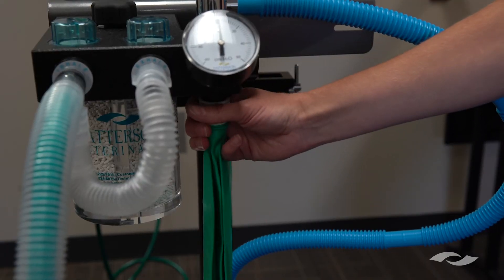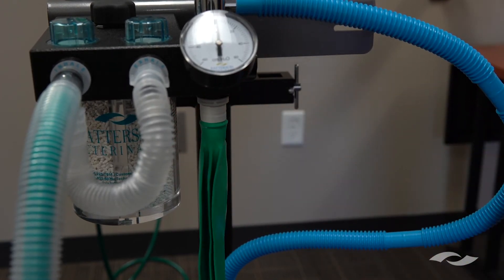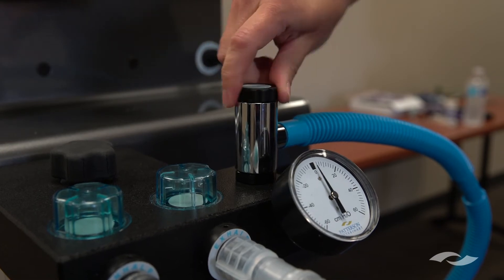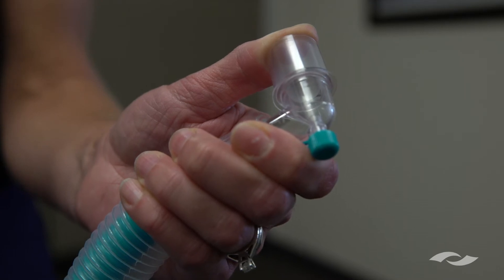Now we'll attach the breathing bag to the bottom of the block at the bag port. The next step is to close the pop-off valve all the way. And now I'm occluding the end of the breathing circuit at the patient elbow with my thumb.